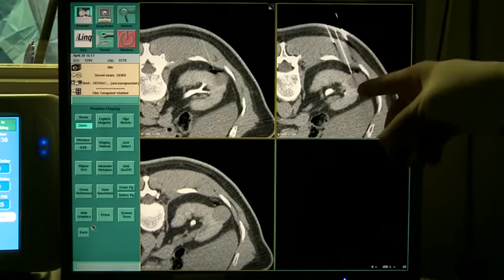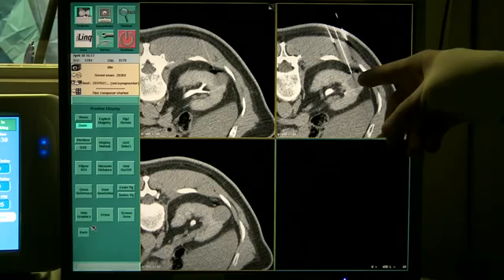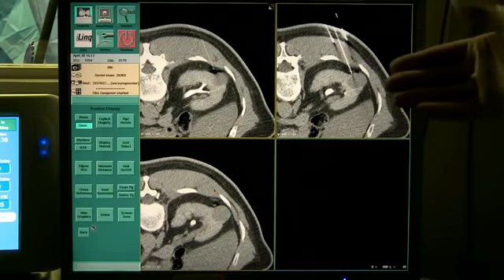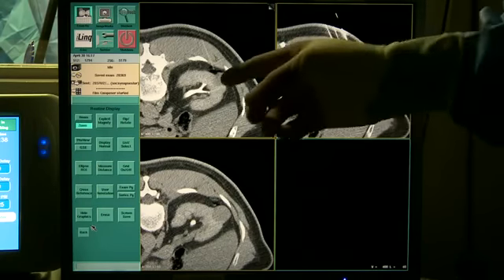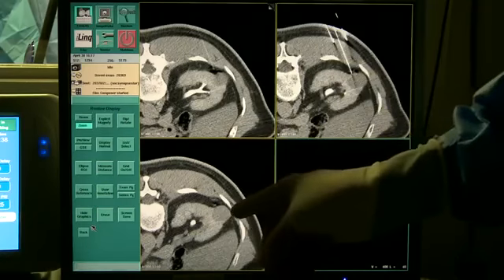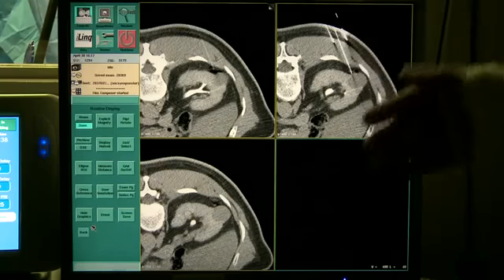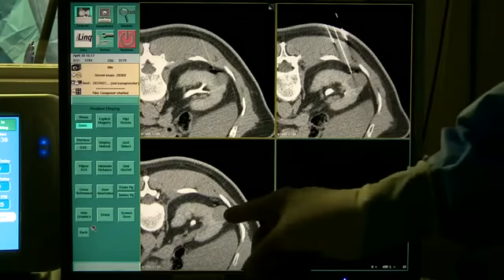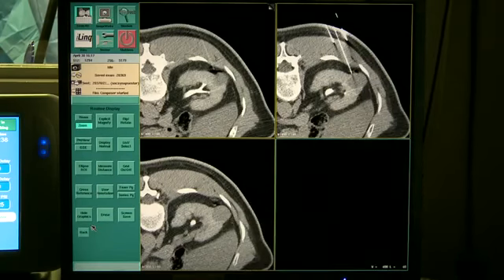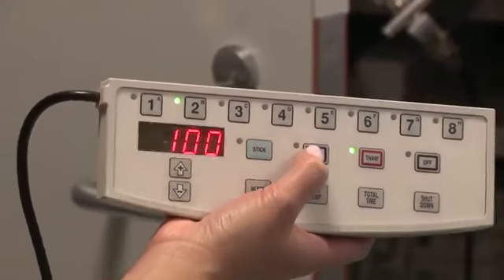I like the medial marker needle to take out the medial portion of this lesion. Then you have to ask yourself what's above and below the lesion. Below it, we're running out of tumor. Above it, we still have a lot of tumor. So this more lateral needle, I'm going to bias a little higher so it'll fall into this plane. So we're going to run the argon cycle on probe 2 now.